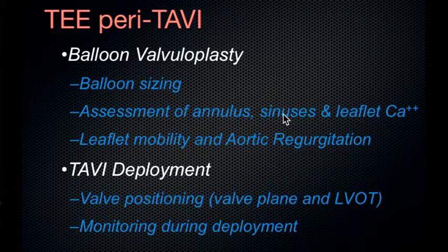We have already seen an example in another section on this DVD, assessment of the right coronary ostium and obstruction of the right coronary artery during balloon valvuloplasty, which caused us to cancel a TAVI case. So that's a good example of how it can influence your management and how echocardiography can be very, very helpful. Then following the balloon valvuloplasty, we want to assess any leaflet mobility and any aortic regurgitation, because sometimes you can get serious AR following the balloon valvuloplasty, and that you need to know about and act upon quickly.